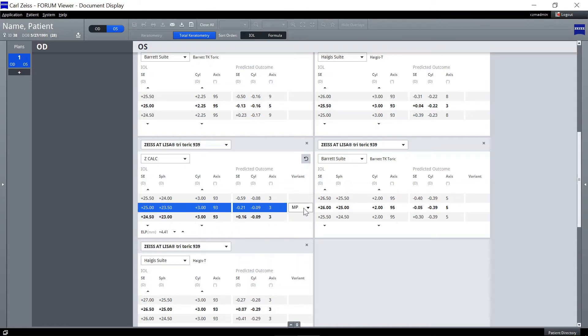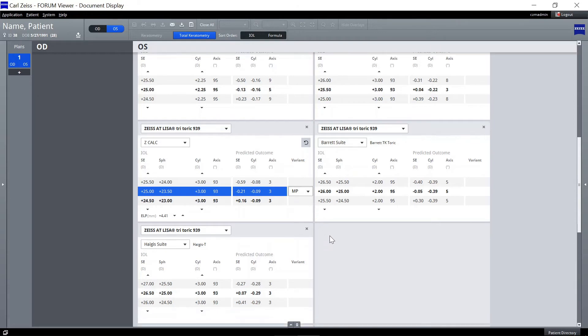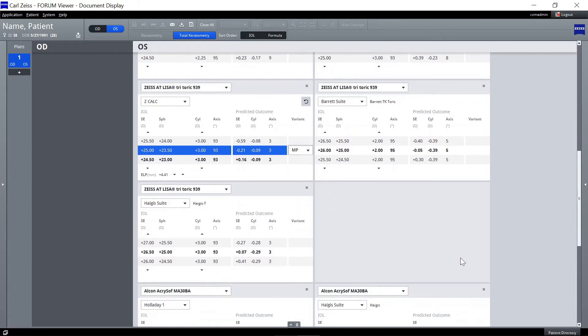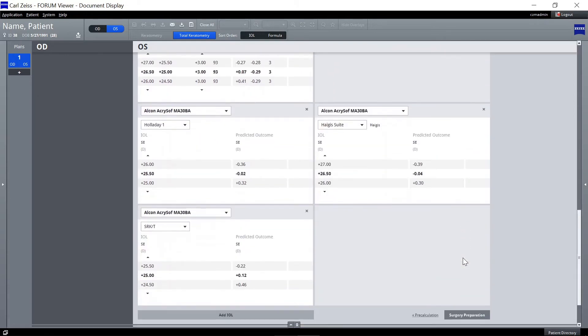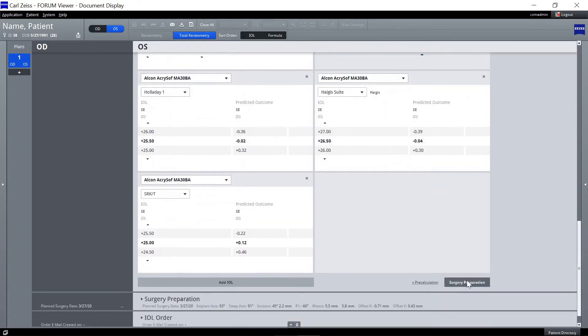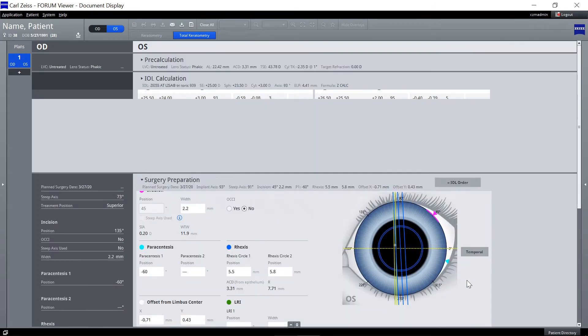Furthermore, select the type if applicable and then click on Surgery Preparation to proceed to the next workflow step.